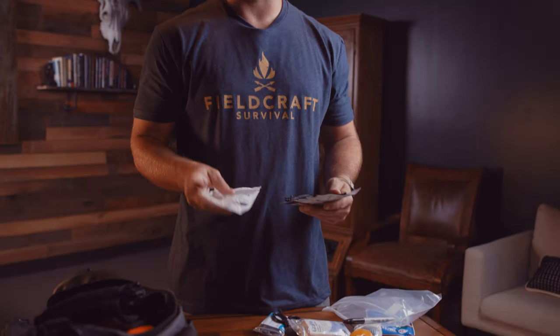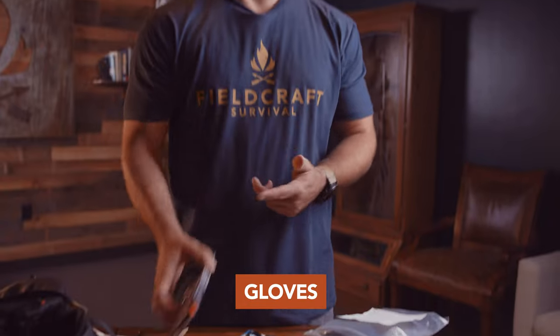Moving on to the A in a MARCH assessment, I have a nasopharyngeal airway. There are a lot more studies about these lately showing that the way we've been measuring them might not always be the most helpful, so making sure you're up to date on how and when to use them is super important. I've got my gloves to keep myself safe. After airway, I move on to respirations — that's where my chest seals come in again.